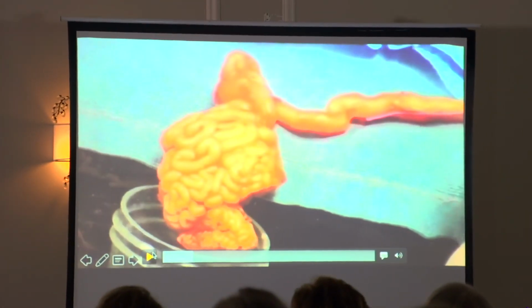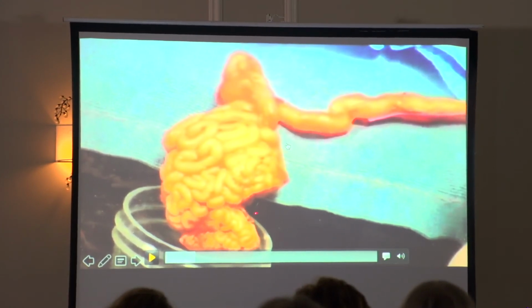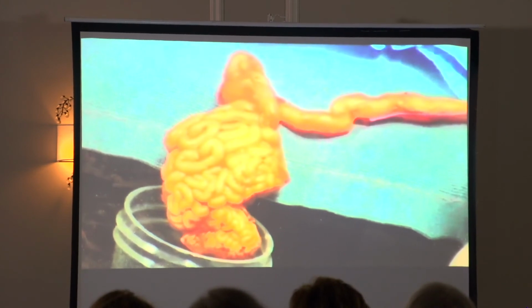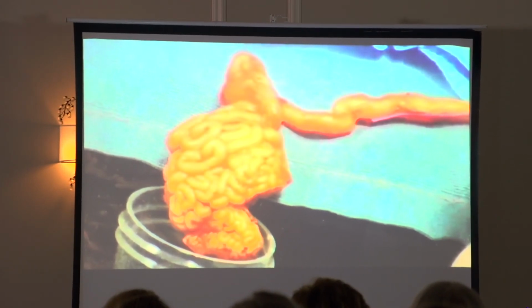I'm just going to pause it really quick. So the ductus deferens here has been transected on one end, and the tail of the epididymis has been transected on the opposite end. A tomcat catheter has been threaded into this ductus deferens here, and then semen extender will be pushed through and flushed. If you watch down here, you'll see where the sperm-rich fraction will come out, and then you'll notice all these tubules getting a little bit bigger as we flush extender through.